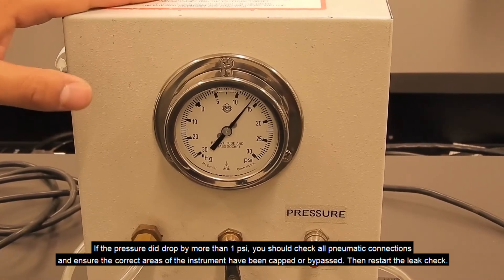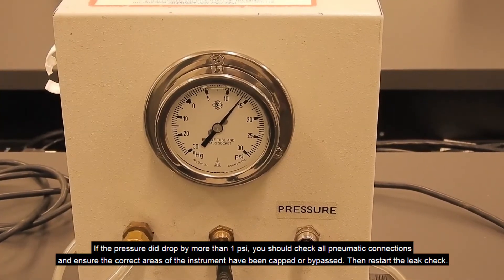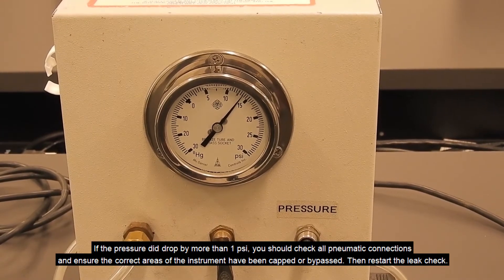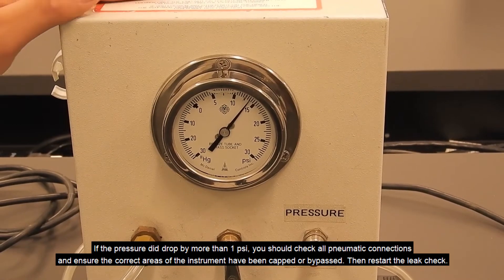If the pressure has dropped by more than one psi, then you'll need to check all the pneumatic connections, ensure the correct areas of the instrument have been capped or bypassed, and then restart your leak check.